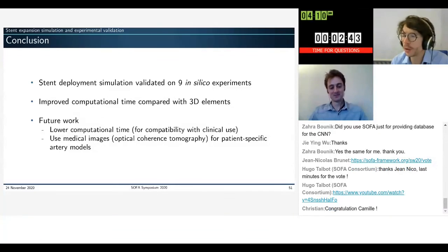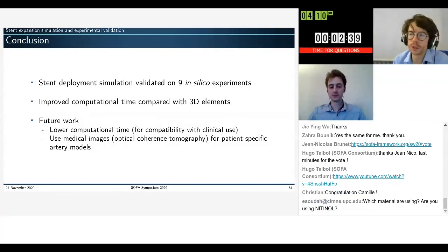So you're basically able to load different shapes of stent, right? Yeah. But is the process automatic? The discretization of the stent is not automatic, so we have to treat each stent model separately, and it represents like 1 or 2 days of preparation. But once one stent model, one stent brand, let's say, is implemented, we can reuse it with any stent of this brand, any dimension, basically.